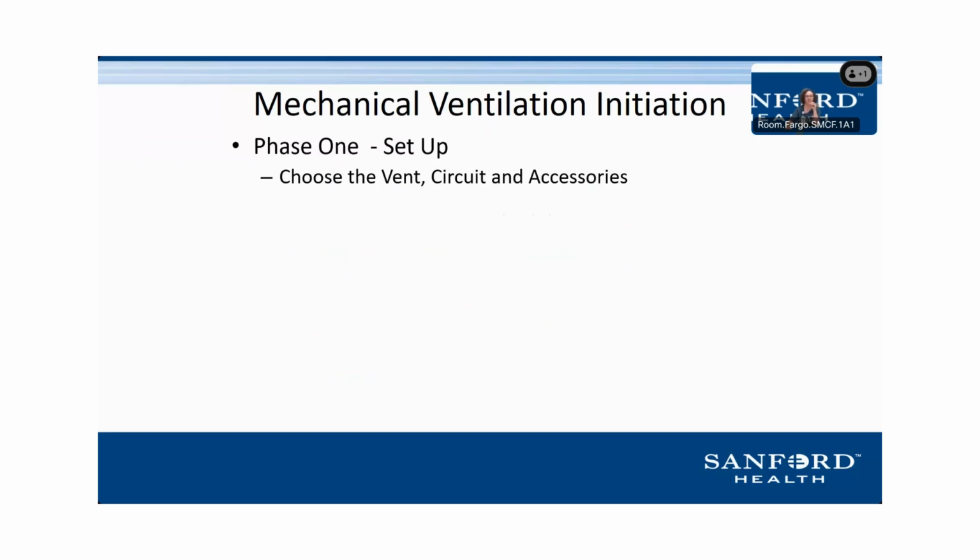So the HME, heat and moisture exchanger, that we're going to use to try to preserve the mucociliary tract function. We have suction catheters, inline suction catheters, sterile suction catheters. We have elbows and extensions that we might put in line to make it easier to handle the circuit.